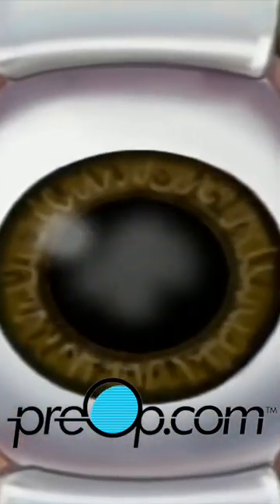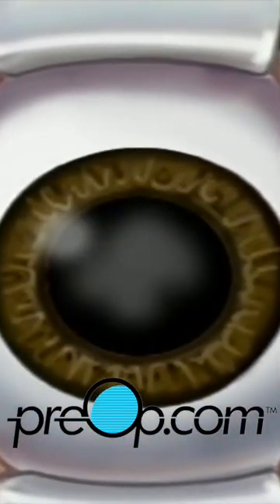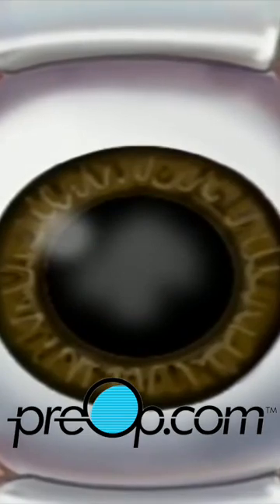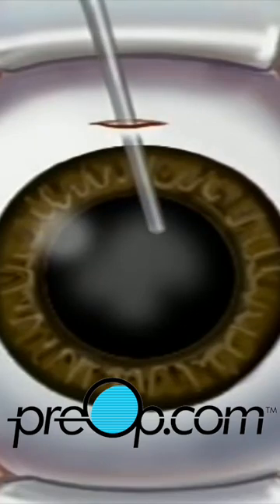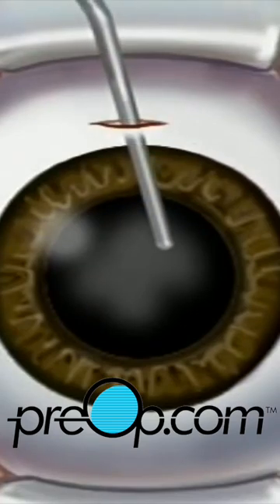By now the pupil will be fully open or dilated. When the operative field is numb, the surgeon will use the microscope to help make a very small incision, just three millimeters above the iris. The lens is located just behind the iris, contained in the elastic capsule. Next the surgeon will open the top of the capsule and remove the lens.